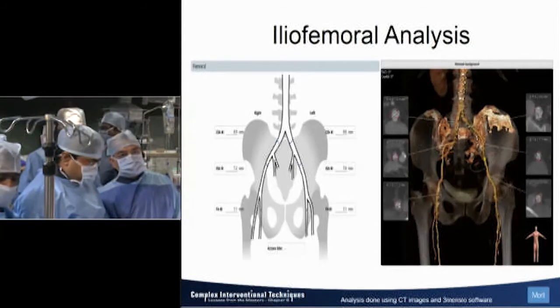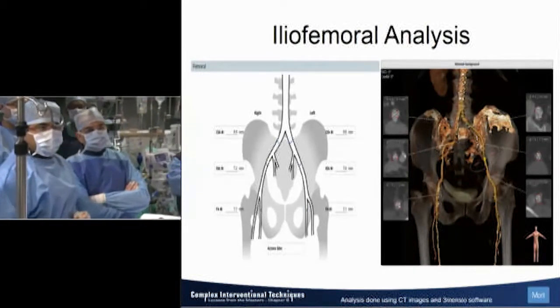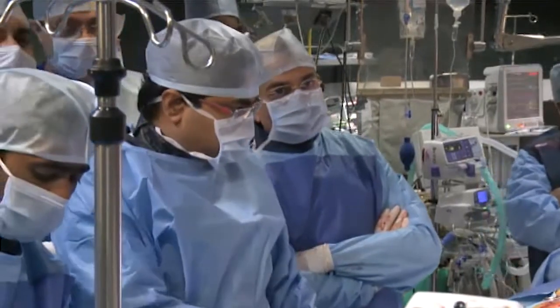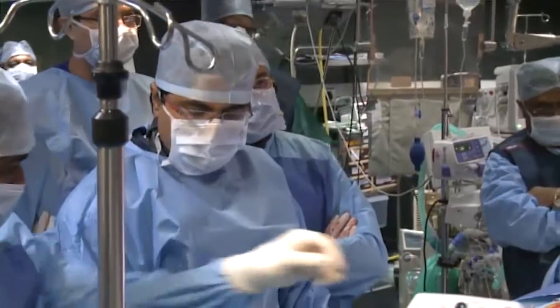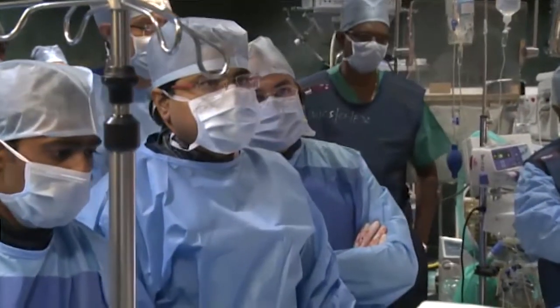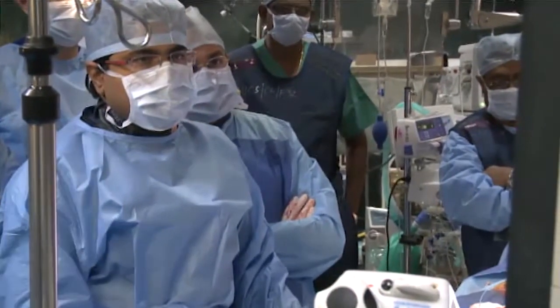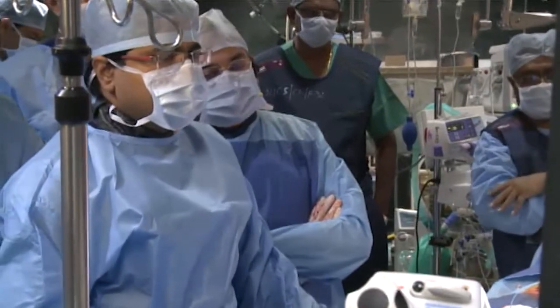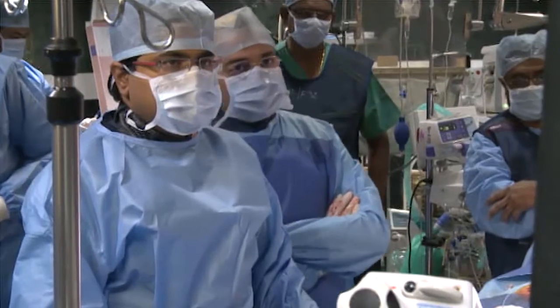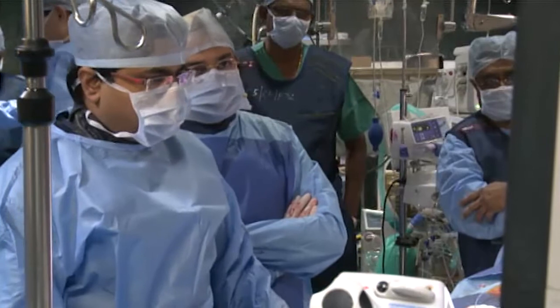So, hello, hi everybody. My name is Dr. Sanjay Mehrotra. Ravinder has already explained to you the details about the patient. She has significant aortic stenosis but low EF, but right now I don't see much of a gradient in this patient. Two concerns doing this valve. One is, of course, the entry vascular access. We don't do pre-dilatation, and now we are ready for the pre-dilatation. Initially, we were planning we'll not do a pre-dilatation.